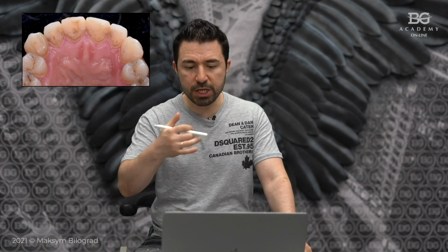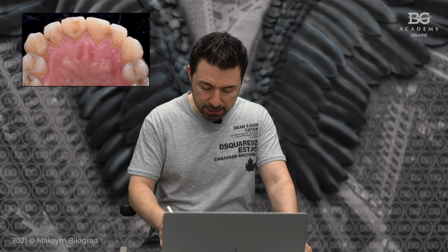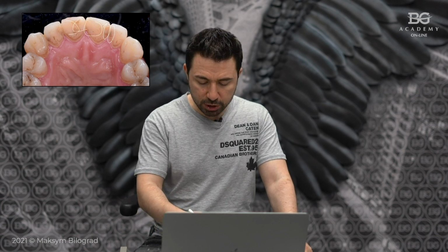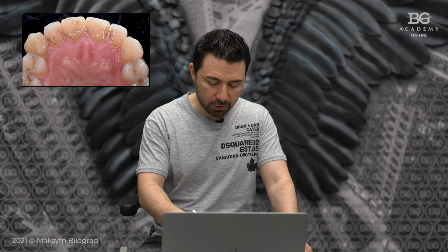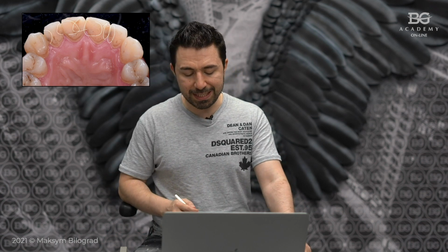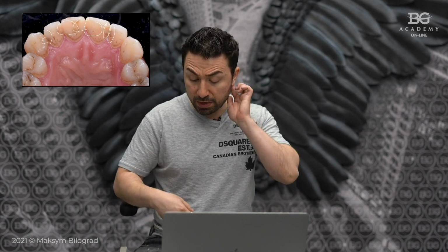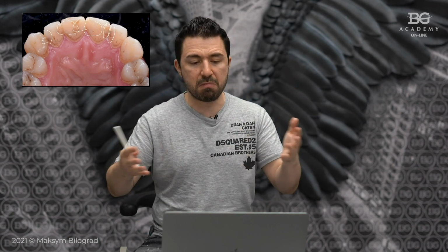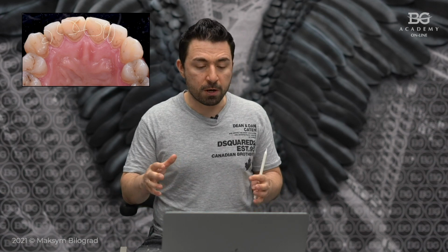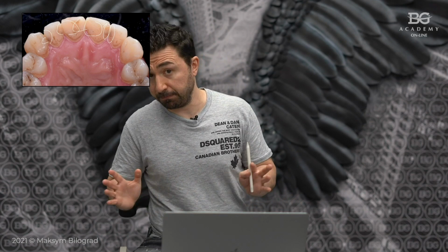So first of all, let's check from the palatal side. From the palatal side, we have multiple caries defects. Here, filling 1, 2, actually no palatal wall on the central incisor, caries. So basically the interproximal areas of these incisors, and maybe the canine here, I don't remember exactly, are affected. So if I would need to prep them, actually we will need to prep anyway because of the caries defects. So my preparations will be caries driven here. Okay, so we have to do that.